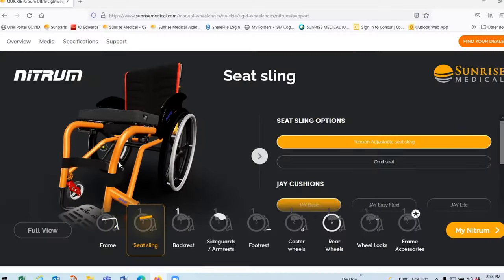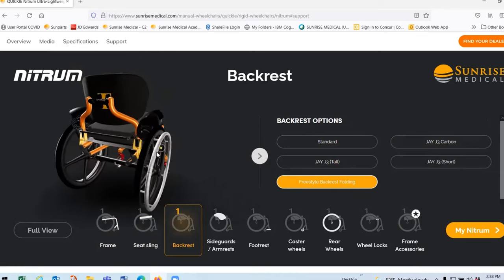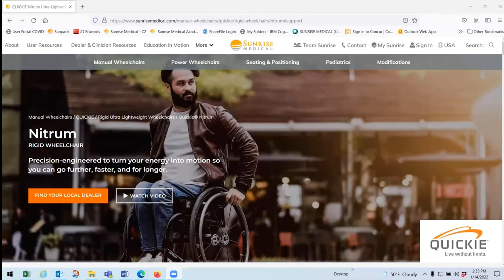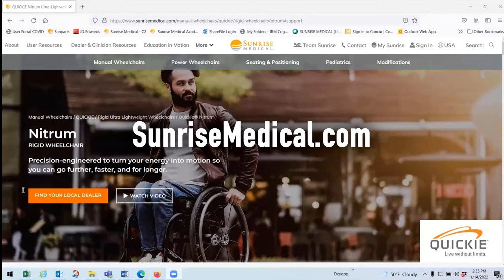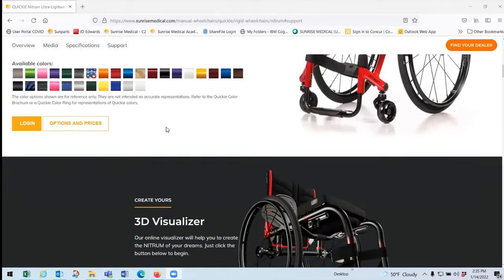It's a great tool because one of the things end users often ask their dealer or therapist is what their chair is going to look like. The 3D visualizer lets you go through different aspects of the chair: choose your frame type, color, fork, caster, and wheels. You can spin it around, and when you're happy with the configuration, print out a PDF and bring it to your therapist. When you go to Sunrise Medical's website and navigate to the Nitrum section, scroll down to find media, specifications, support, and features — then click 'Start' on the 3D Visualizer.